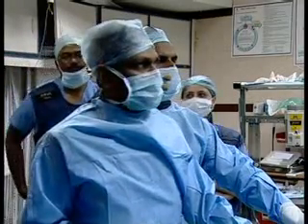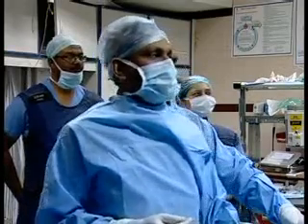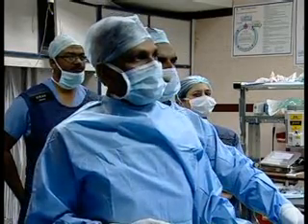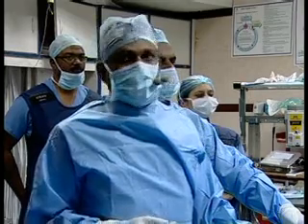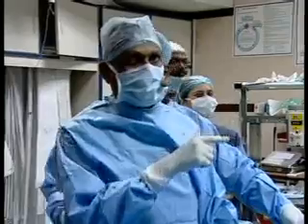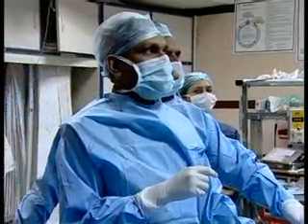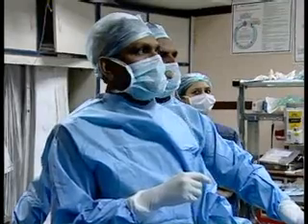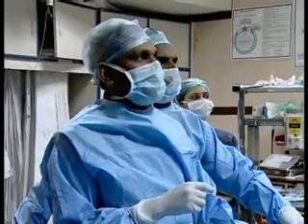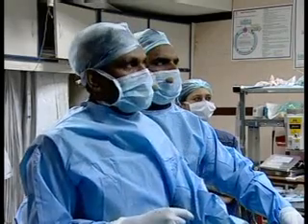Yes. Most of us are very comfortable closing muscular VSDs because it is away from all the important structures of the heart, the aortic valve, the conduction system. But the controversy is with the perimembranous VSD. I think today Nagesh has the largest experience all over the world in closing perimembranous VSDs with the ADO2 device. And of course we all have to wait.